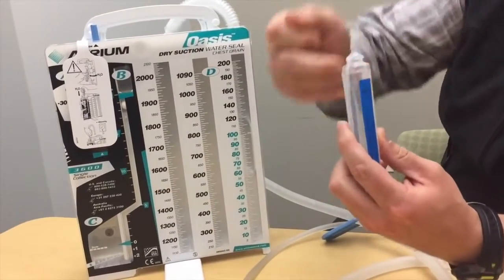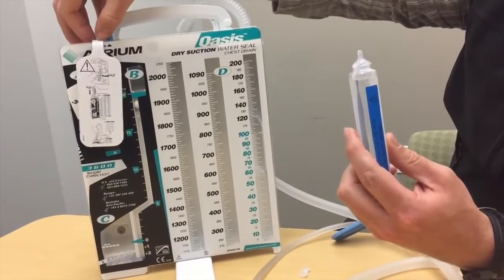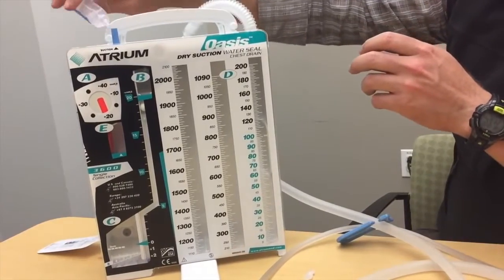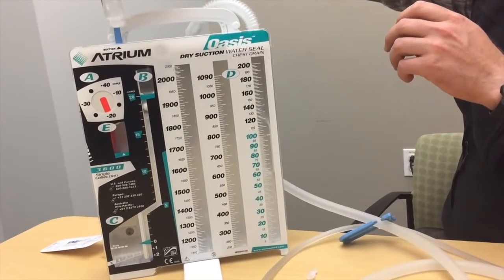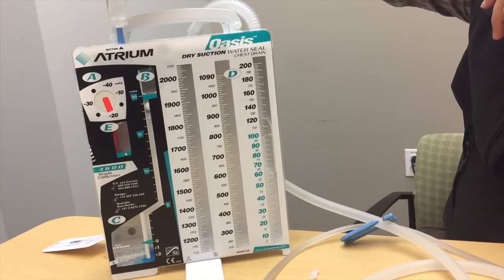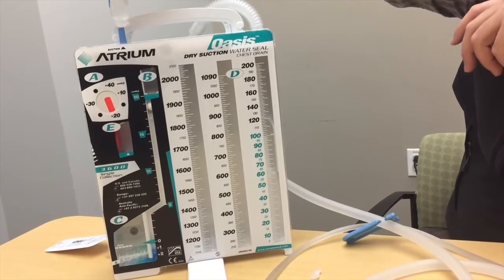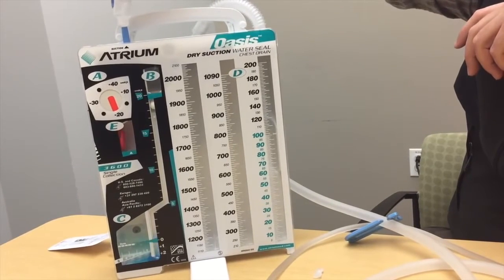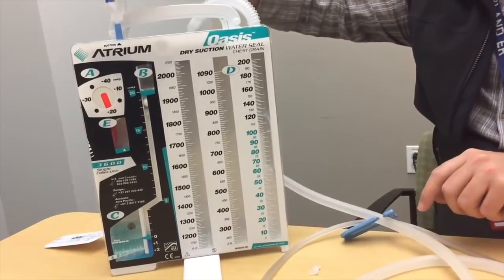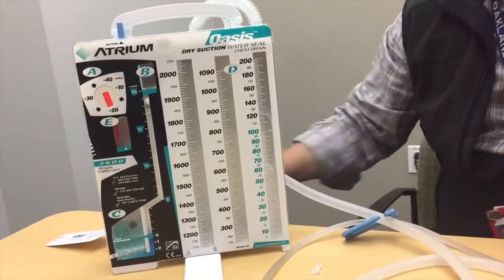Setting up the water seal is as simple as pulling off the cover, pulling the tab out of the water seal compartment, and dumping the entire thing in. It looks a little like a blue toilet bowl of water. Once it's all the way in, the dye takes effect and you get blue water everywhere you need it to be. You'll notice we're up to the zero mark, which will come into play once we start operating it.